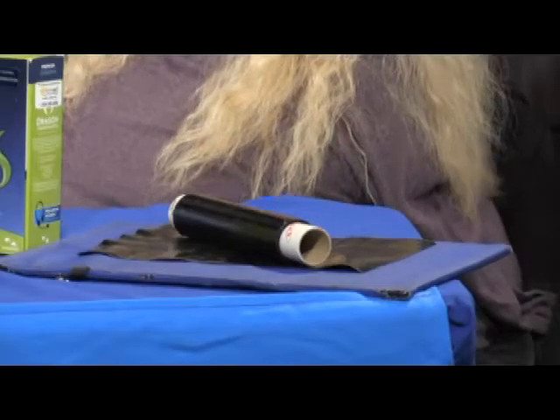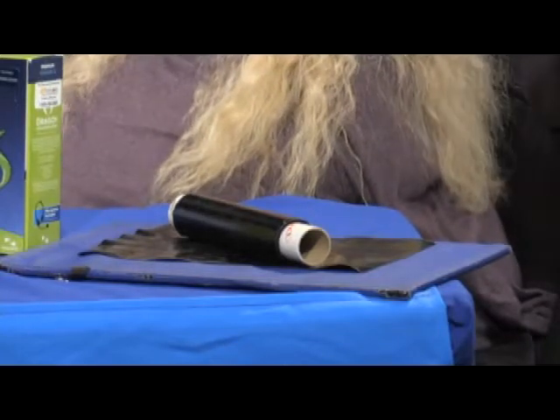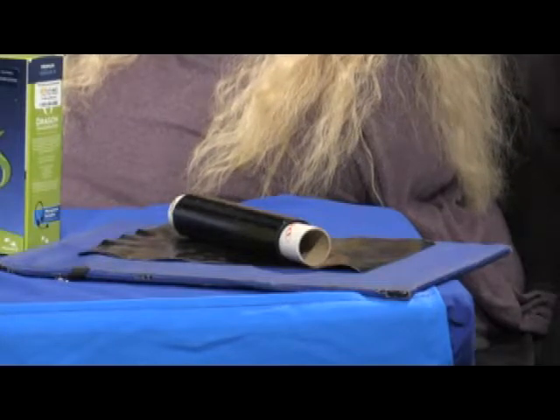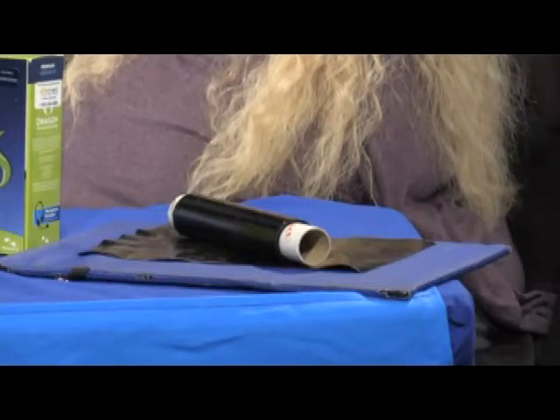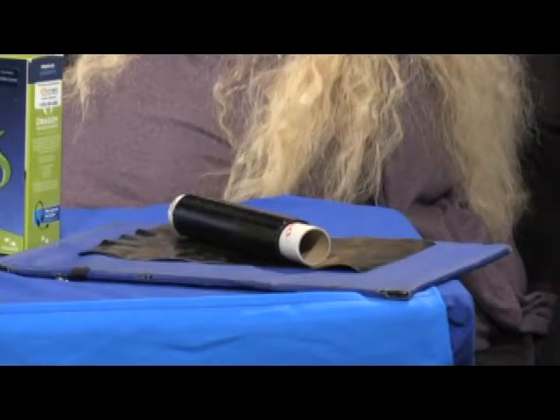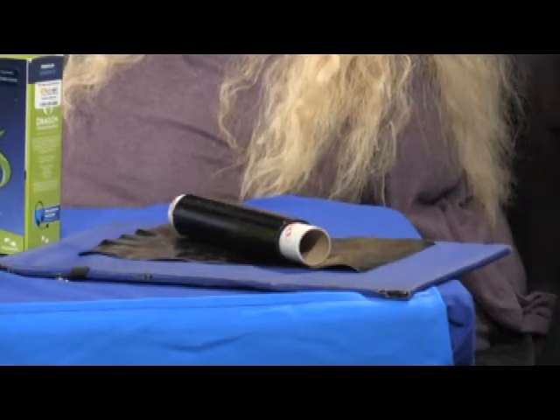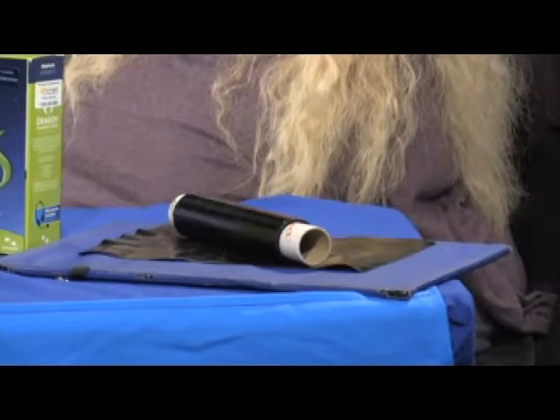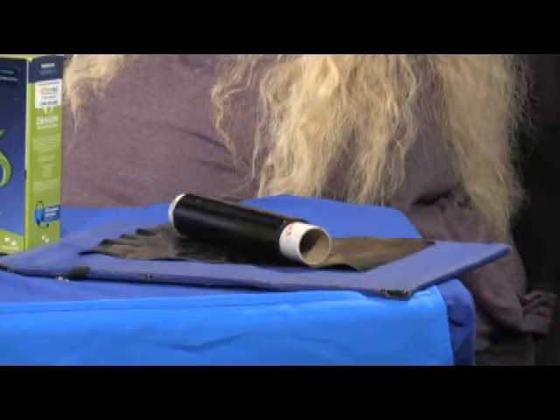There's a couple things on there. There's a lap board that somebody who's using a wheelchair can put on their lap, and they can carry items pretty easily. And the black stuff that's on top of that is called Dycem. You can use it to open a jar, or that's what it's for. You can use it any number of ways to help you grab something. Cool. And I like the non-skid surface too. That's always helpful. It doesn't stick to your clothes or your hands. And it's clean, and you can rinse it off and reuse it.